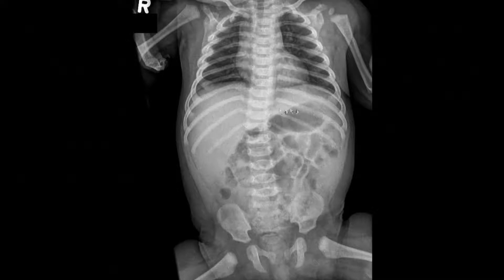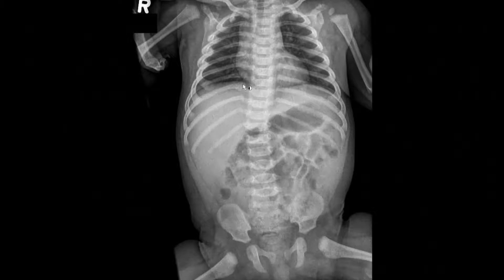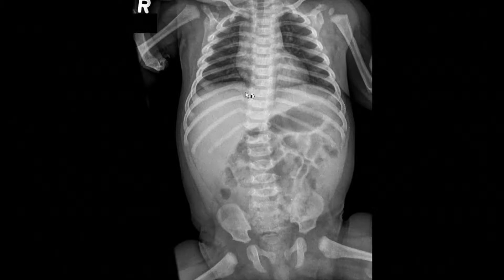In addition to the normal findings in the chest and abdomen, for the soft tissues, there are old healing rib fractures involving the right seventh, eighth, and ninth ribs. This is highly concerning for non-accidental trauma. The acuity rank is priority. The physician taking care of the patient should be immediately notified and an additional skeletal survey has to be obtained.